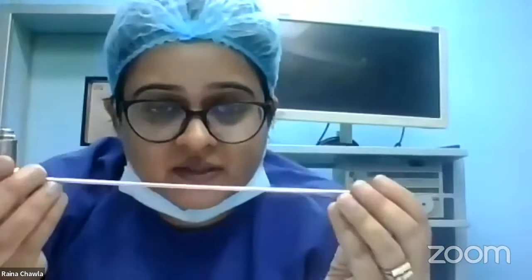Again, we have diagnostic hysteroscopy. Say a patient comes with abnormal uterine bleeding and you want to take a directed biopsy. So we do a hysteroscopic guided biopsy, which is the gold standard for taking an endometrial biopsy. Or say she has a submucous fibroid, that is a fibroid in the endometrial cavity, and you want to remove it. So we do a hysteroscopic myomectomy. Or she has an endometrial polyp, we do a hysteroscopic polypectomy. Or she's infertile with a septum, we do a hysteroscopic septal resection. So this is the hysteroscope. We visualize the inside of it.